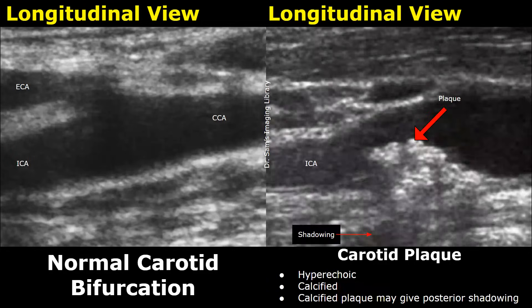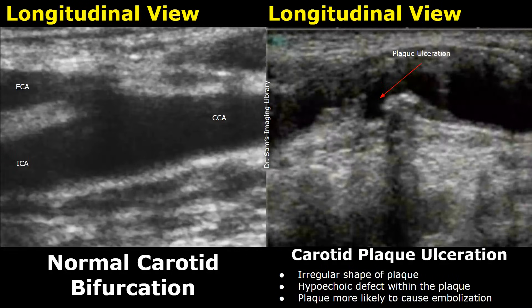Here is another image of a plaque in the internal carotid artery. It is a calcified plaque that is hyperechoic and also has posterior acoustic shadowing. Carotid plaque ulceration is difficult to see on ultrasound, but in some cases, if it is prominent, it can be seen. Its features include irregular shape of the plaque and hypoechoic defects within the plaque. This type of plaque is more likely to cause embolization.